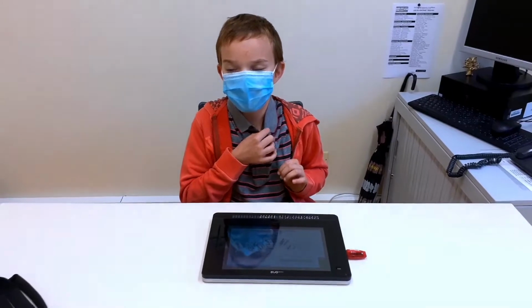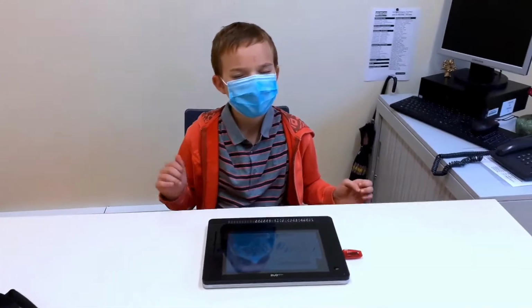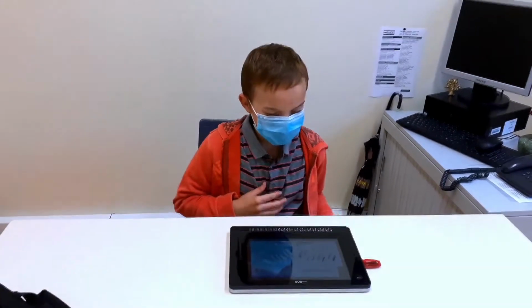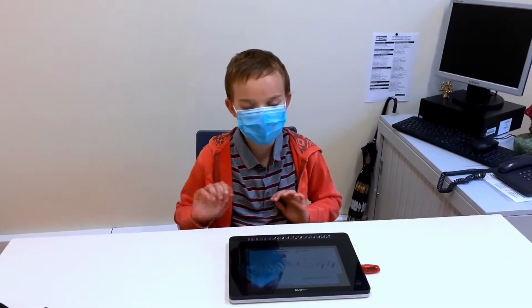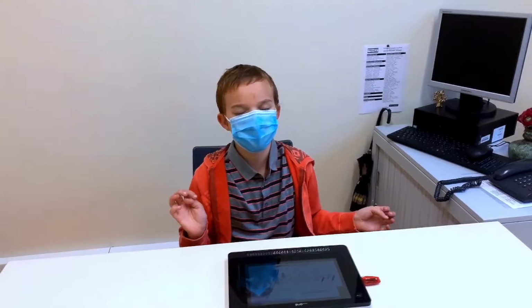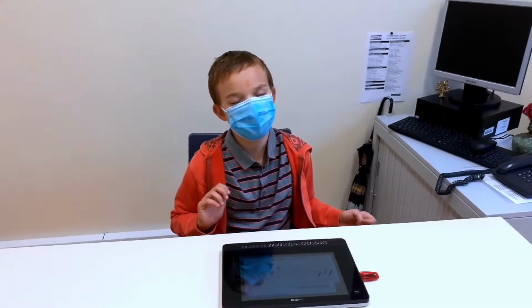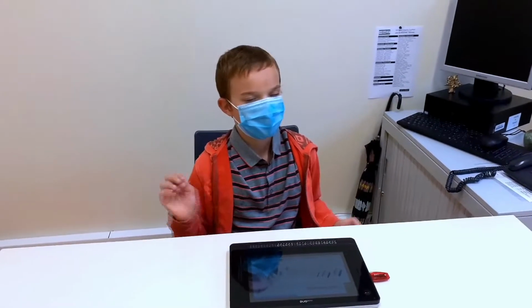How does this insideONE tablet help you compared to the Perkins Brailler? Before, when I was using a Perkins Brailler, I had to insert sheets of paper, roll them up, and then I could Braille using Perkins keys. I had a cursor, and when the bell rang at the end of the line, I had to advance to the next line and move the cursor all the way to the left.